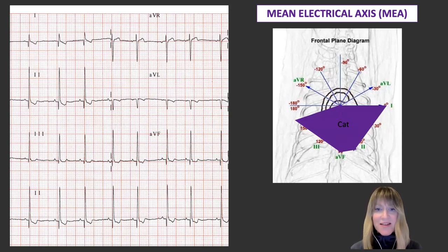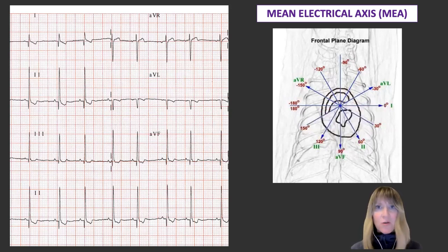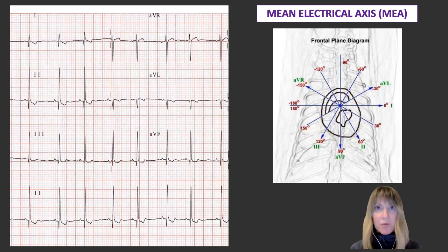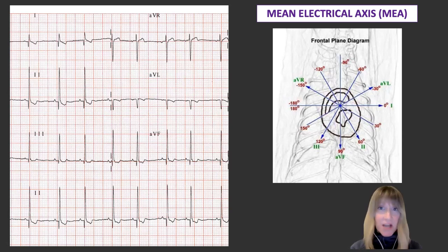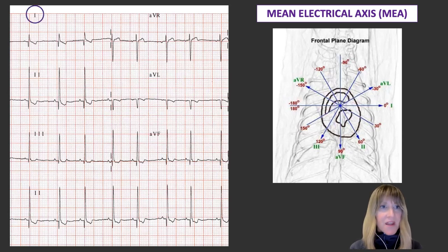Let's work through this ECG of an 11-year-old female spayed golden retriever using a method called the isoelectric method. Step one is to identify which of these frontal plane leads has a QRS complex whereby the negative components — the Q and the S — are roughly equal in height or depth to the positive component, the R wave. Looking at these six frontal plane leads, my eye is drawn to lead one, because the Q and the R are about equal in size. So that's my isoelectric lead.